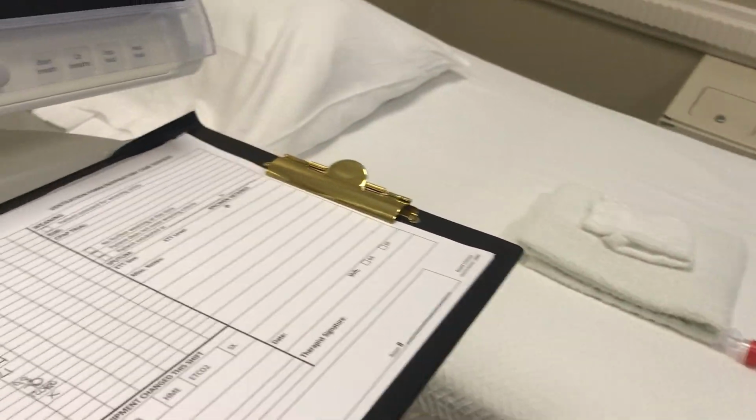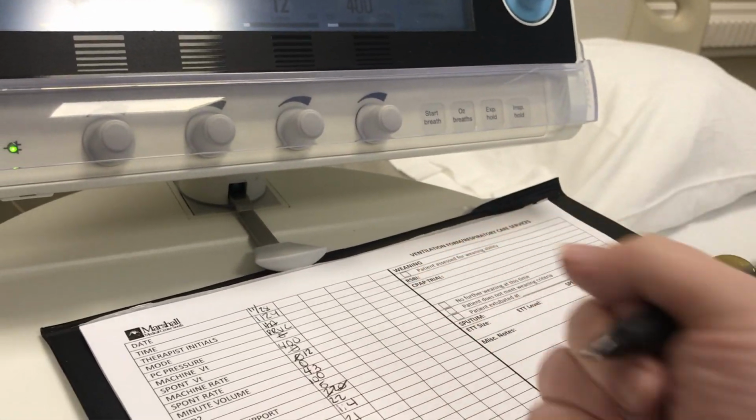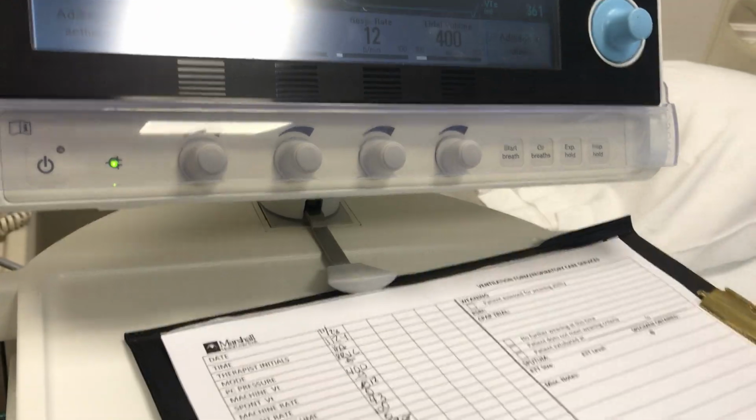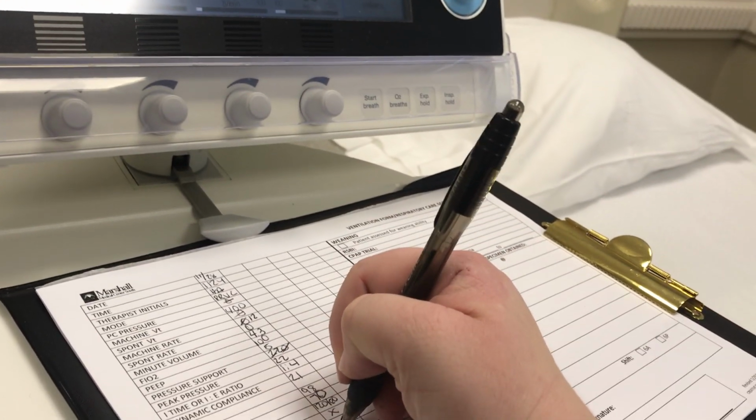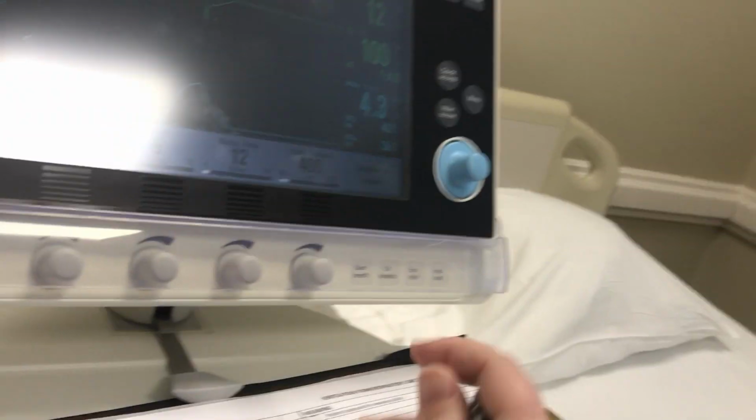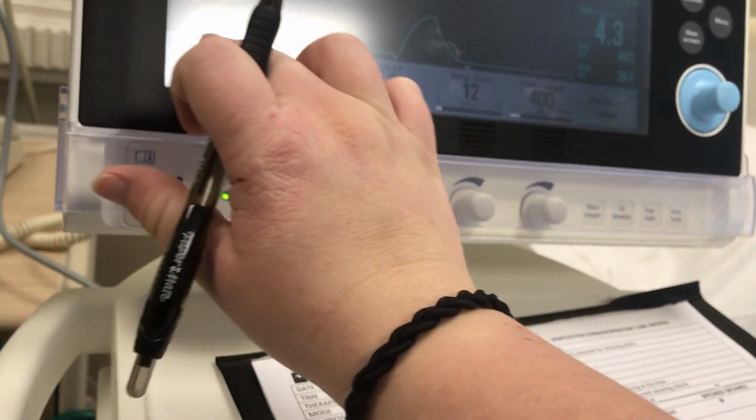I've already assessed them, so I heard my bilateral breath sounds. I would check my alarms, make sure they're on and working.